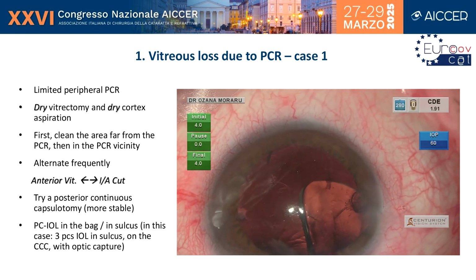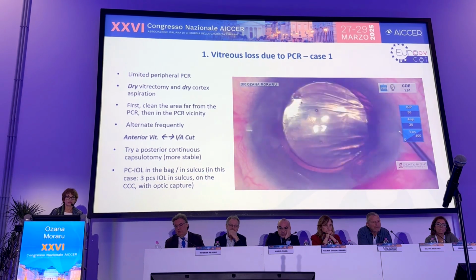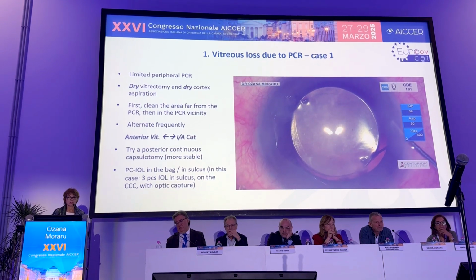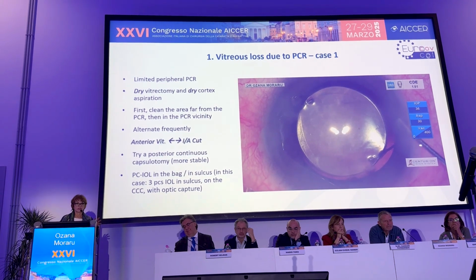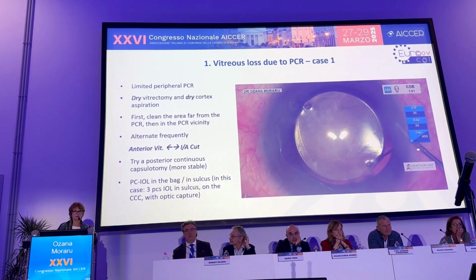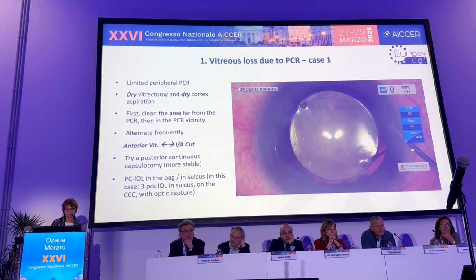At the same time, you don't want to use the cutter when you are in the periphery, because there is a danger of damaging the anterior capsule, which is very important to create your support, like in my case, to implant a 3-piece IOL in the sulcus with optic capture. So again, master the foot pedal and the 2 modes, IA cut mode and vitrectomy mode, when you deal with remnants of cortex or even with nucleus pieces.